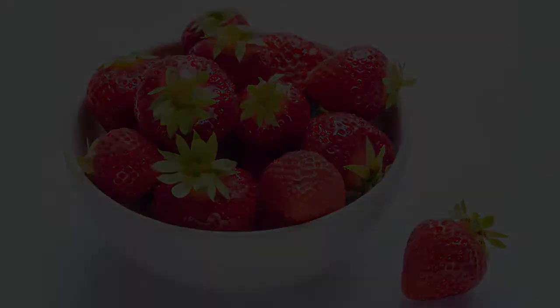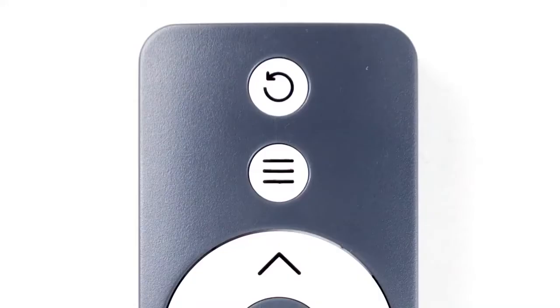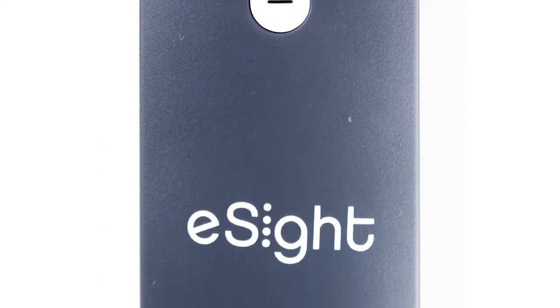Users can also manually adjust the focus or brightness, though most users prefer our algorithms to do that for them. Next, let's use the Bluetooth wireless remote. Using the remote, users can access all the vision controls integrated in the headset.